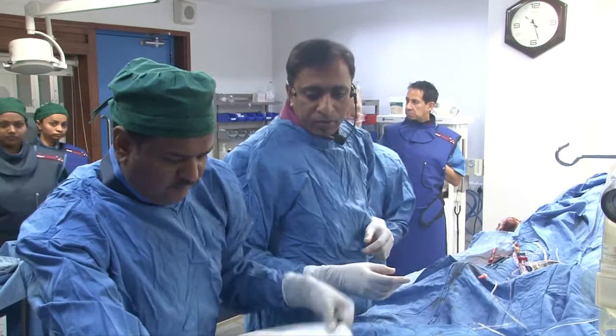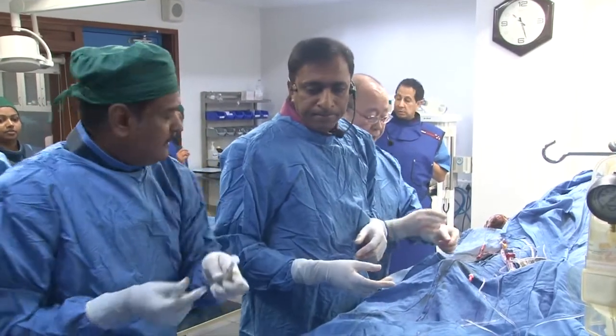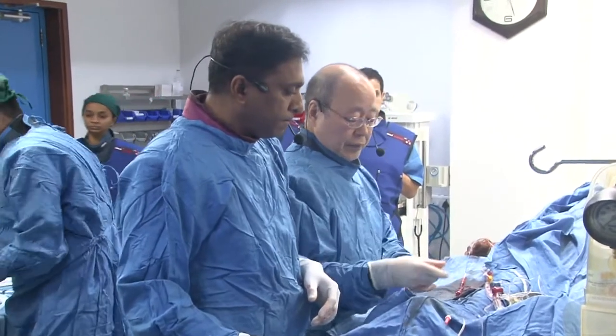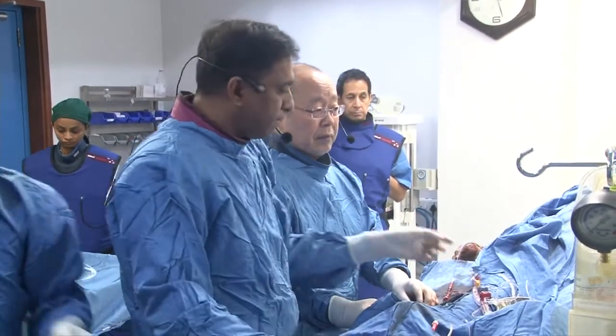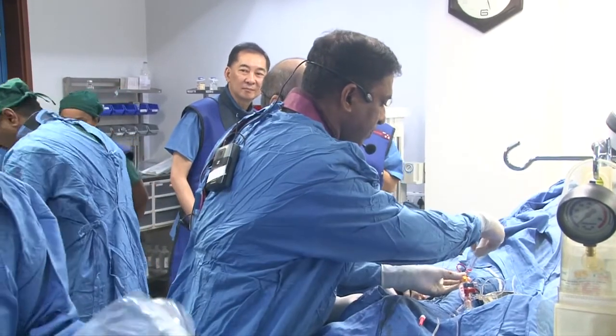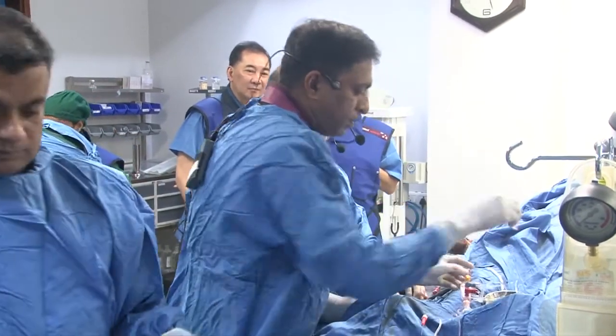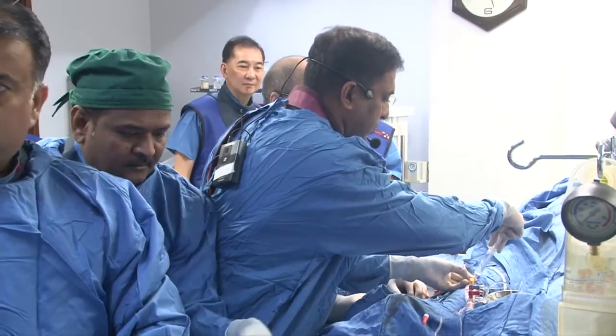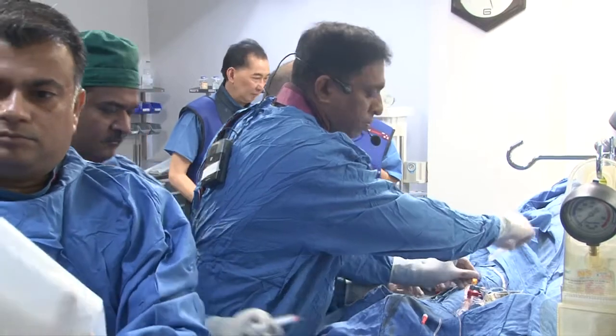So perhaps at this stage you could explain to the audience what you're looking for with your intravascular imaging. Because I think many people here would just put another balloon and inflate, but we would like to learn from you what you're looking for with OCT here.